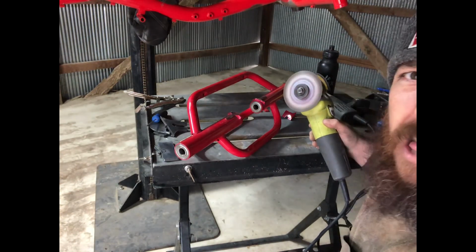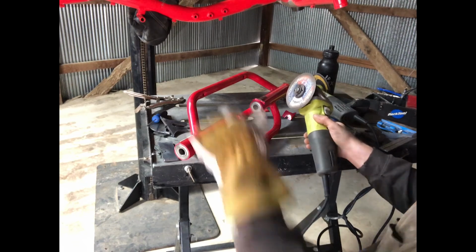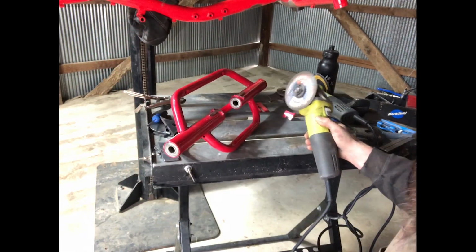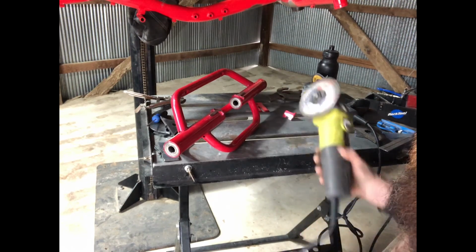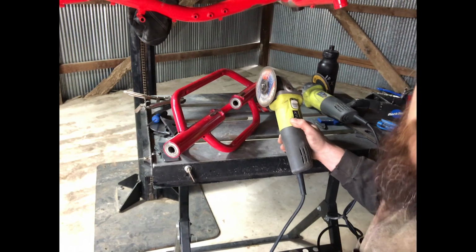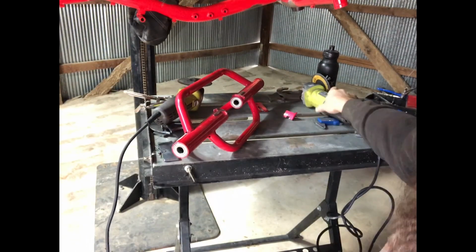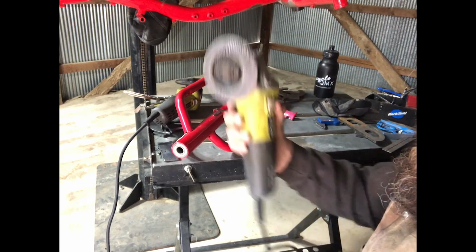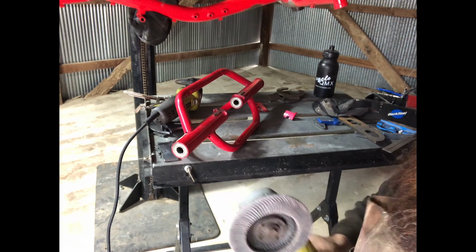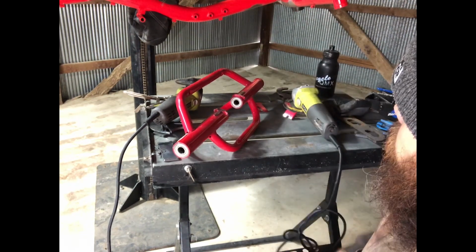Oh, I love the smell of metal in the morning, don't you? That's it. All chopped up, cleaned up. Now we just gotta hit with the sander. A little grinding. You know what I say? Bada boom, bada bing. So we're gonna go ahead and switch over to the sander. I like having two grinders so that I'm not always having to switch the heads out. So I just keep one with the sander on it and then one with the cutter on it.